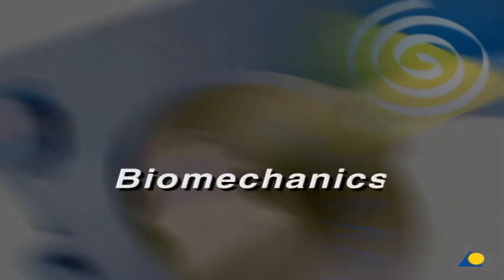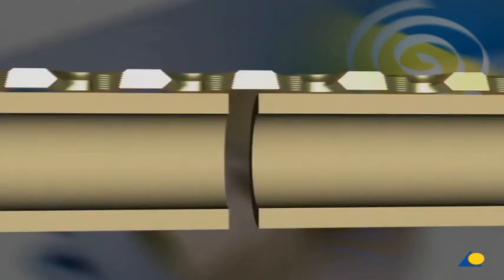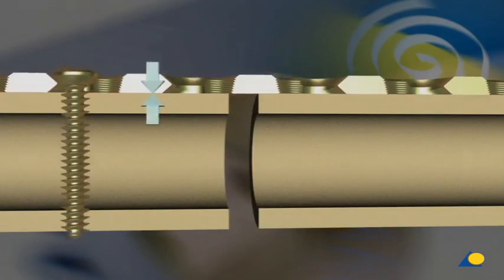Biomechanics. In the conventional technique, tightening of a screw presses the plate onto the bone. The contact pressure causes friction, which enhances primary stability significantly.